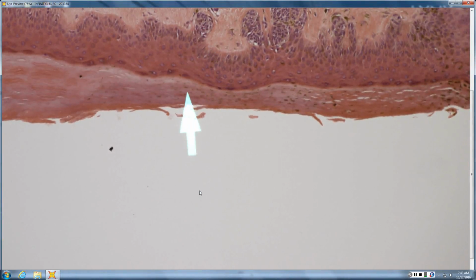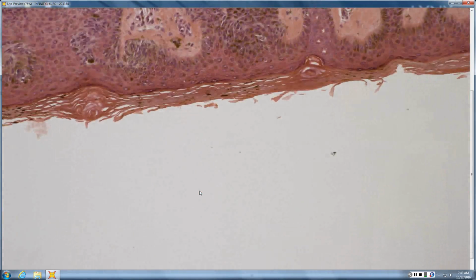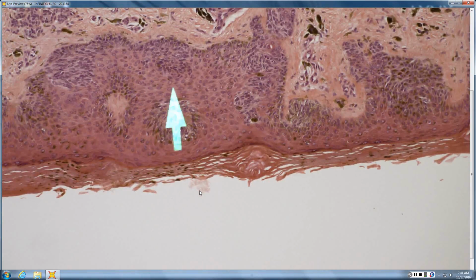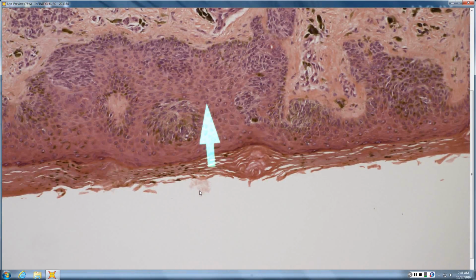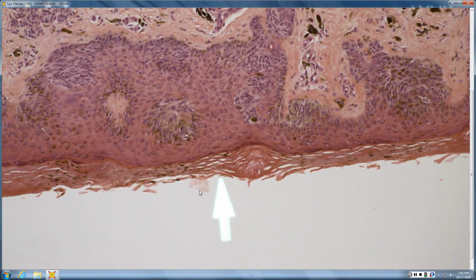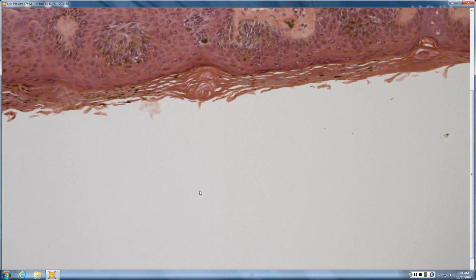So you correctly said acral skin. You said it's small, well circumscribed. It ends in a nest. Small, well circumscribed melanocytic lesions that end in a nest are usually Clark's, benign. And then Christina pointed out the reedy pattern. Where it looked confluent is because you've got a whorl in your dermatoglyphs, so that you have an oblique cut of the dermatoglyphs. If you look up at the corneum, you have nice tight little columns of pigment in the corneum. That suggests that there were nice tight little nests underneath despite the oblique cut, and goes with benign nevus.